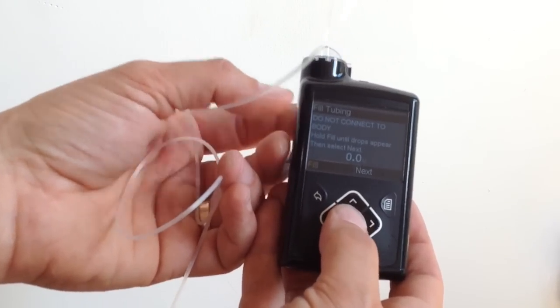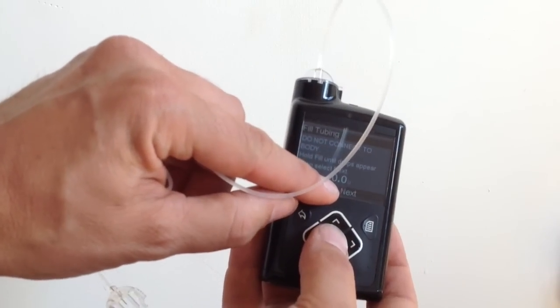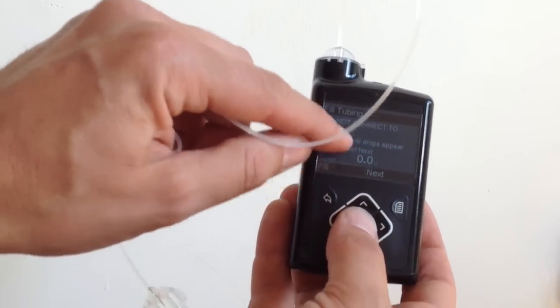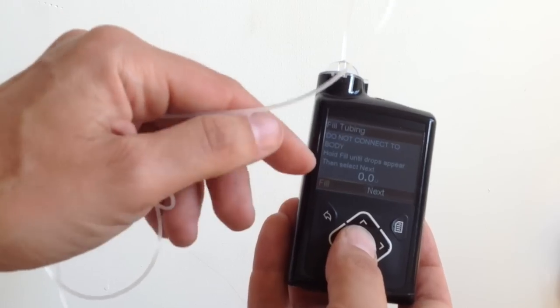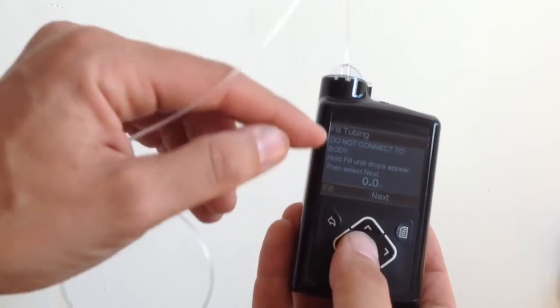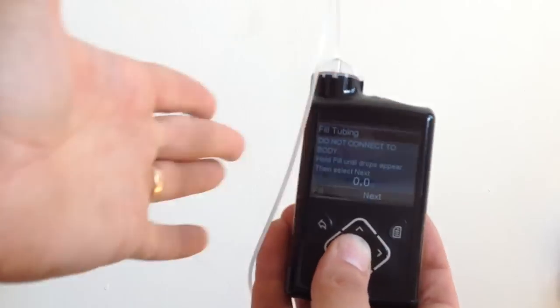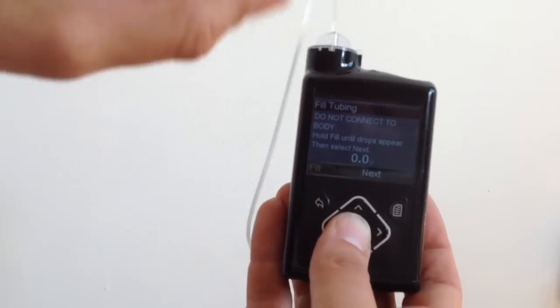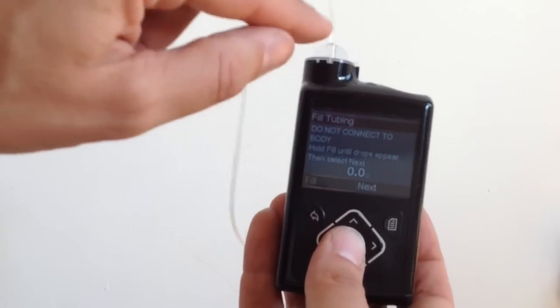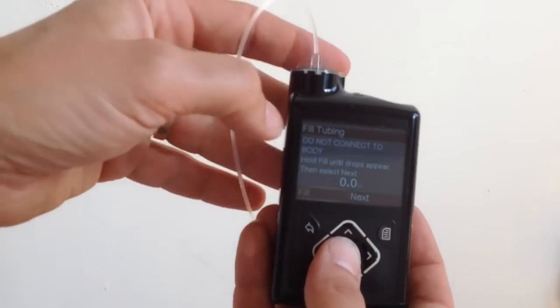So now it's filling the tubing. And you have units of going through the tubing indication there, just so you can check on how much is happening. And you just press the center button to fill. And again, while this is happening, I'm just going to be tapping the pump on all four sides. If there is a little bubble in there, hopefully it'll find its way into the tubing and we can prime it out.